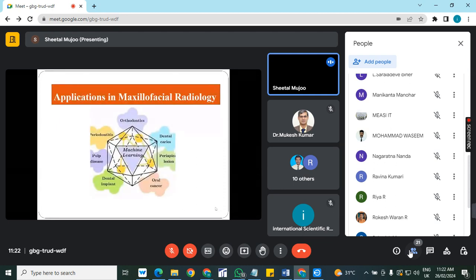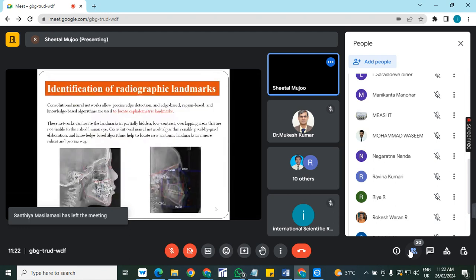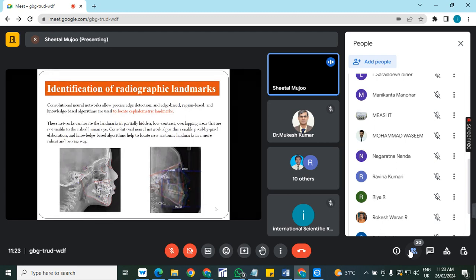Now, this was the general application. Now, because our topic is mainly the application of AI in oral and maxillofacial radiology, let's discuss the application in oral radiology. This is the first thing. It's used in almost all the 9 branches of dentistry. We can use it, whether it is orthodontics or restorative or endodontics or oral medicine, radiology. For everything we can use it, even if you are planning to do any kind of research for a survey or any community screening, anything, yes, you can use it.